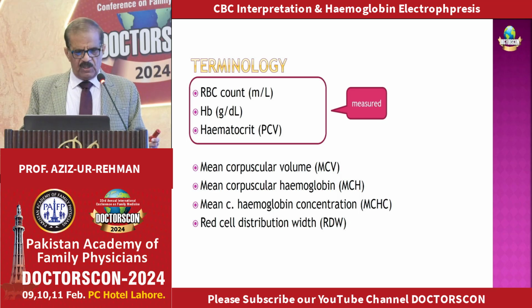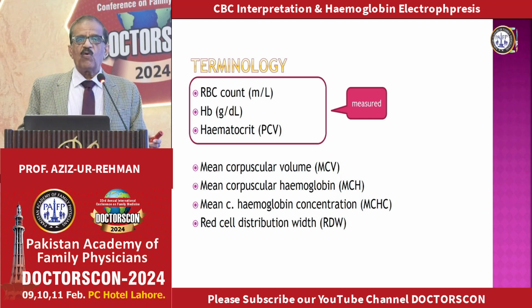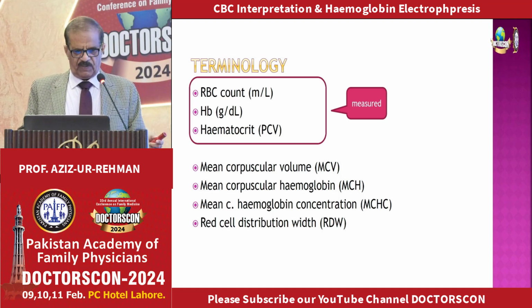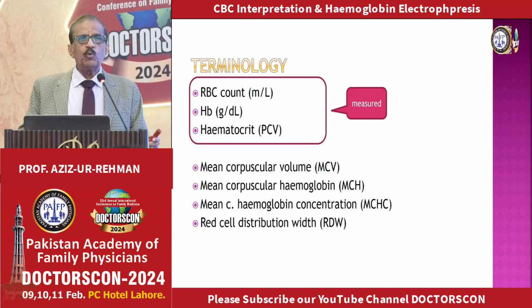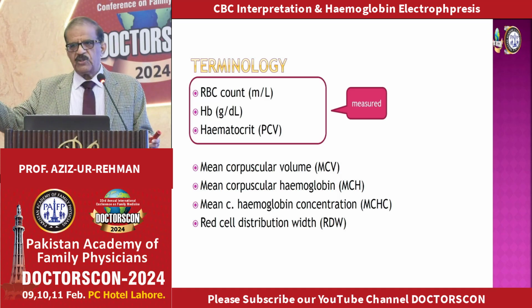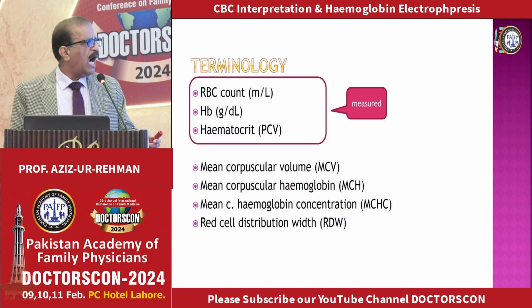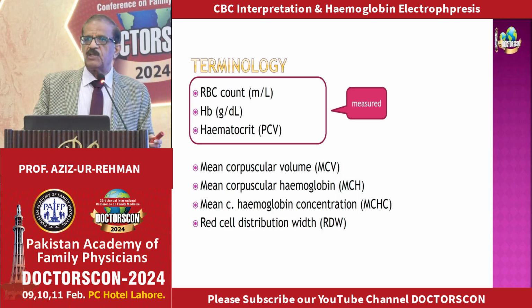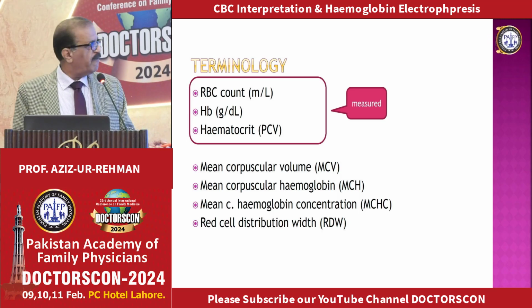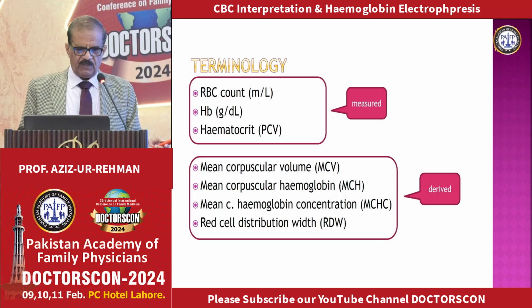And very important parameter is RDW, that is the red cell distribution width. It is not the width of an individual cell, it's a measure of the variation of the cells. For example, there may be two examples. In one case, all cells are uniformly small, and in another example, cells are small, but there is a lot of difference in the cell sizes. In that case, RDW will be different. So in a practical situation, this will help you to differentiate between two important clinical conditions. So these are derived values.